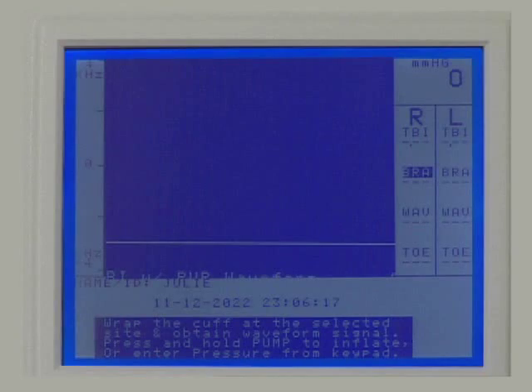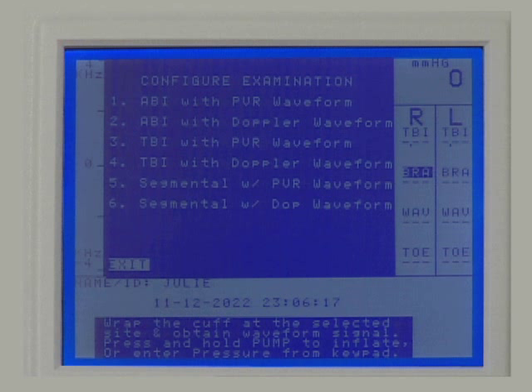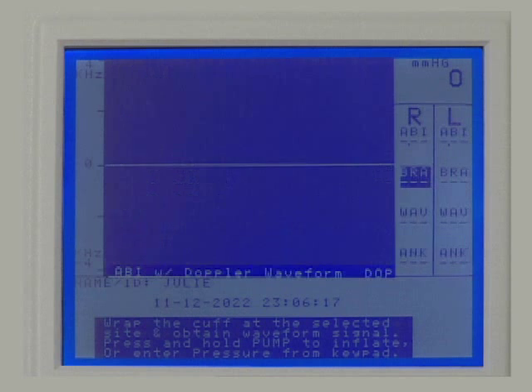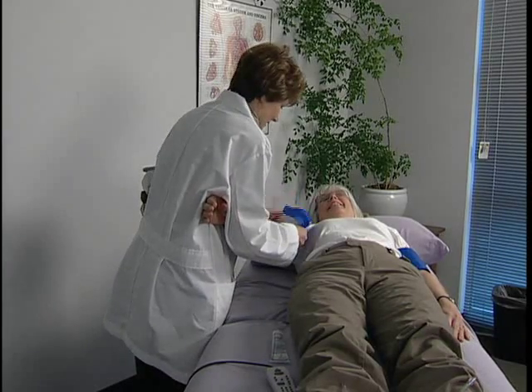Press Enter/Menu to exit system settings. Press Enter/Menu to open the options menu again and press 1 to configure the examination. Press 2 to select ABI with Doppler waveform.